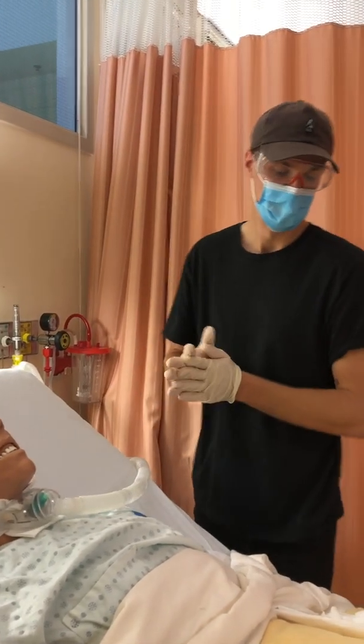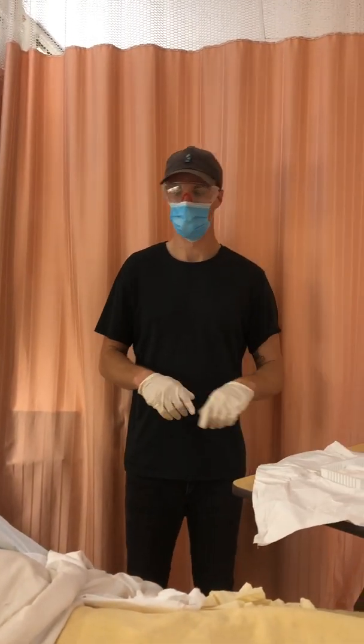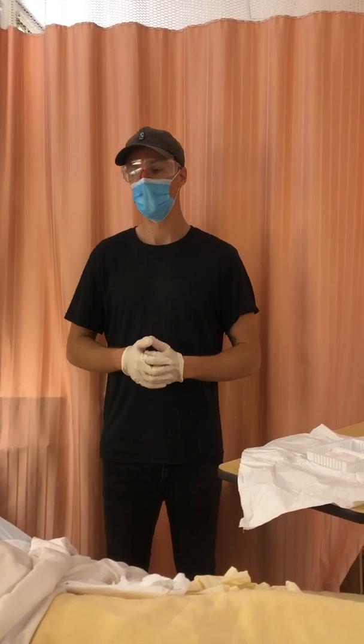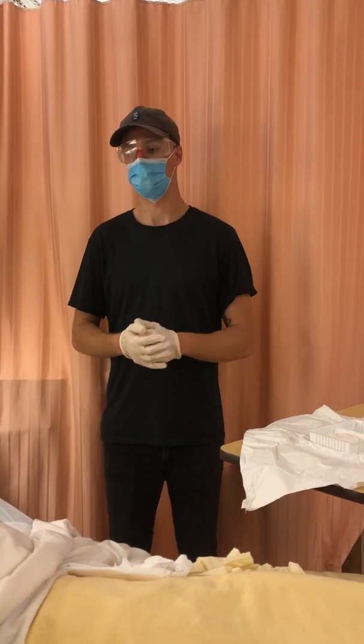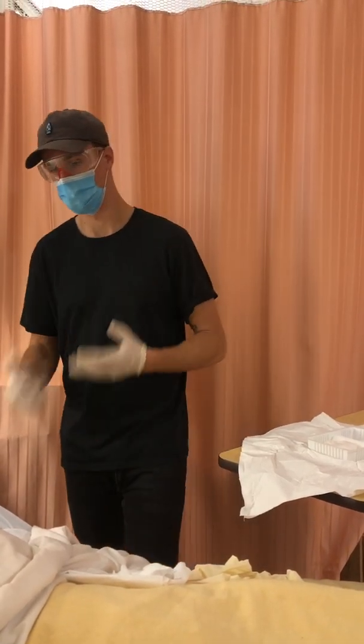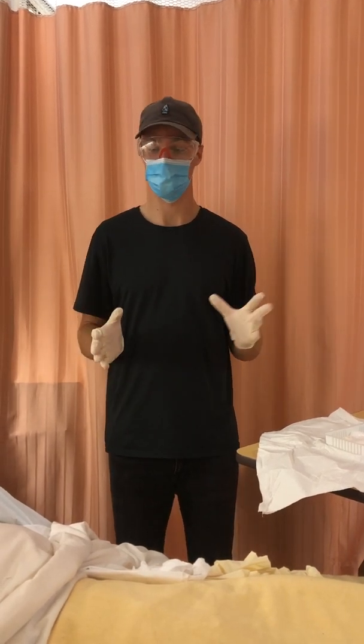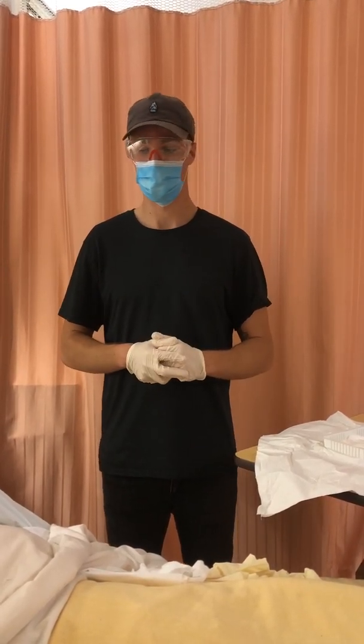Make sure that's on there. And then I'd clean up, I'd lower the bed. I make sure to document how the patient tolerated the procedure. And then I document the state of the stoma, how clean it was, the drainage and whatnot. And I do another safety check as I leave. And that's it.